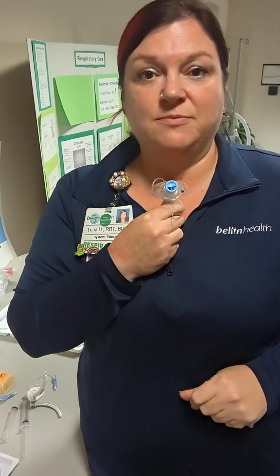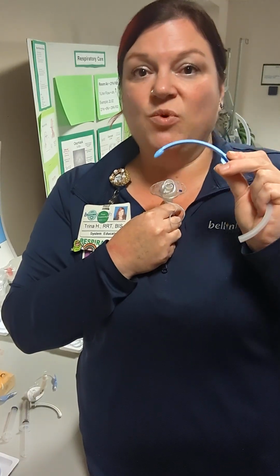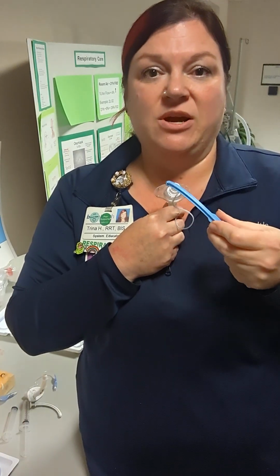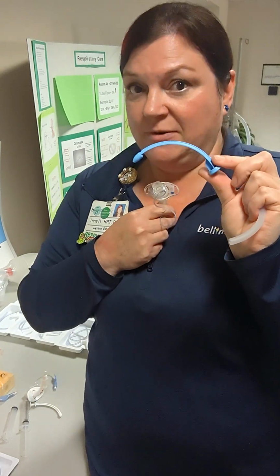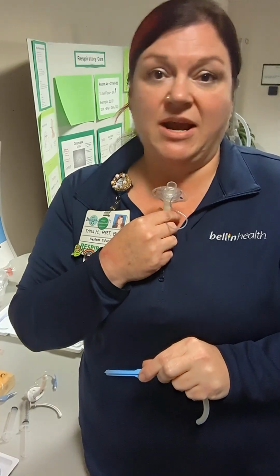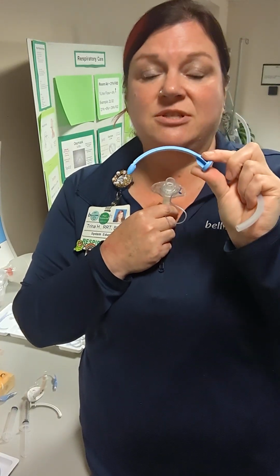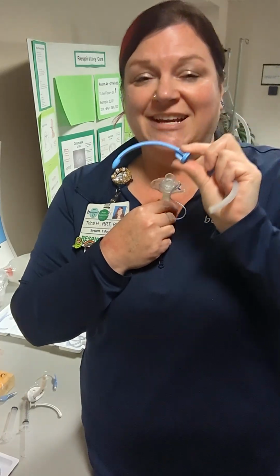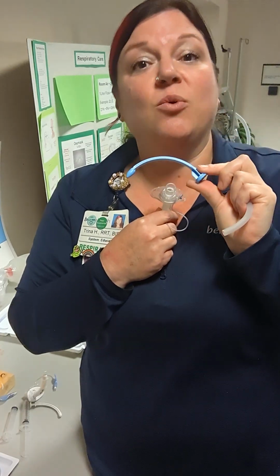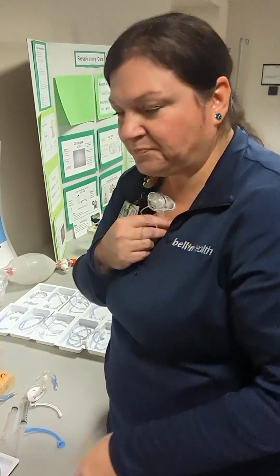Once that airway is placed, now we're going to remove the obturator. This will now only be necessary if we are inserting the trach. It's important to keep track of it though, because you need it in case this comes out and you don't have a backup trach. Do not lose this. This is the first thing you're going to ask about when accepting a patient with a trach. Where is their obturator? Don't lose this, okay?